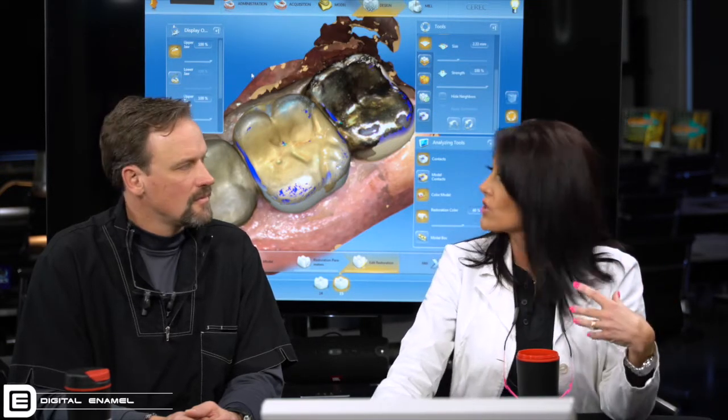What you're going to see here in a second, once I get rid of all this on both 14 and 15 — we're assuming this was their preoperative condition, so this is where they were prior to when they came into the office. So you remove that, and we feel confident when we do that that our restorations are going to go in with no adjusting, if any.